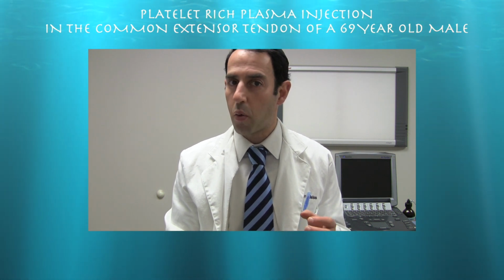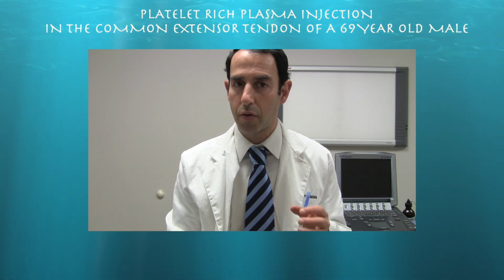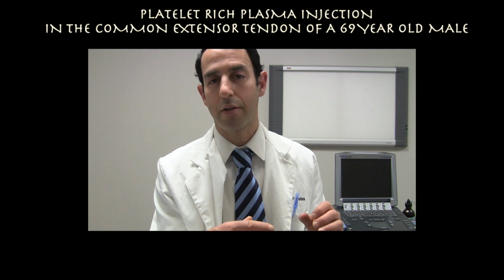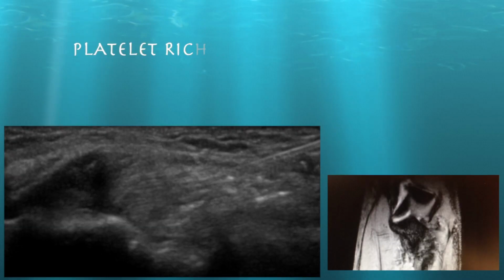During this procedure, he found it quite uncomfortable, and I think we were not able to get the needle exactly into the defect during this procedure. If we had to do this procedure again, I would opt to have the needle go right into the defect, more proximal and superficial to where it was during this procedure.